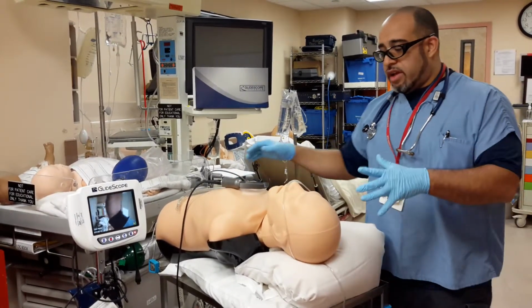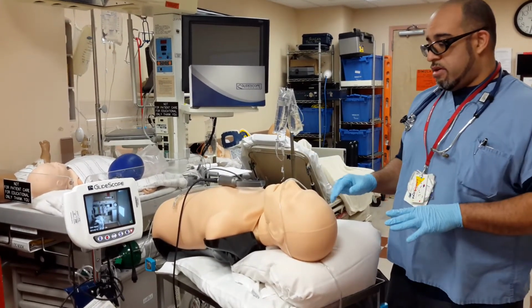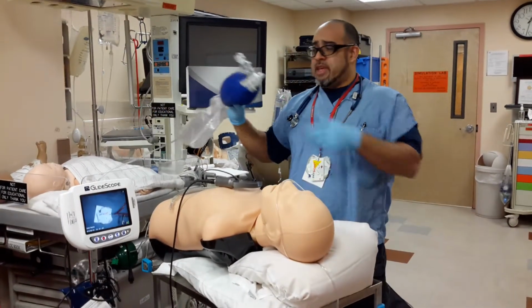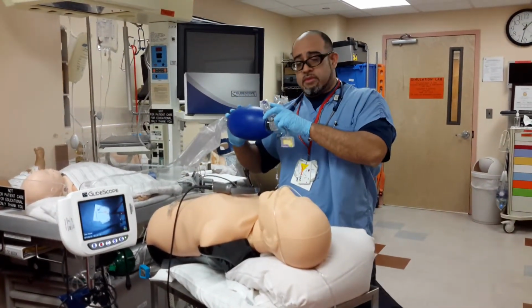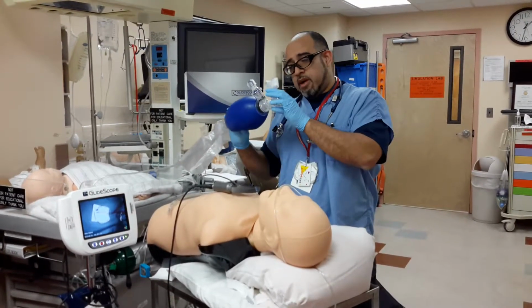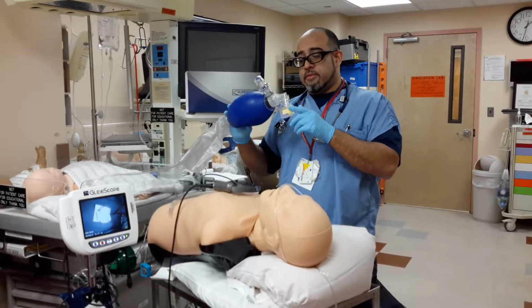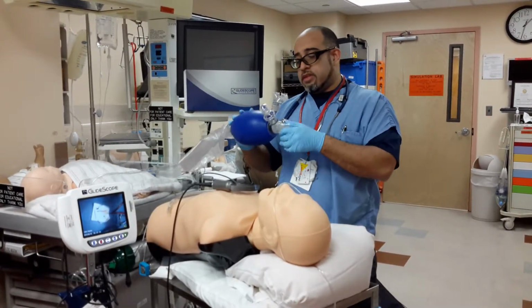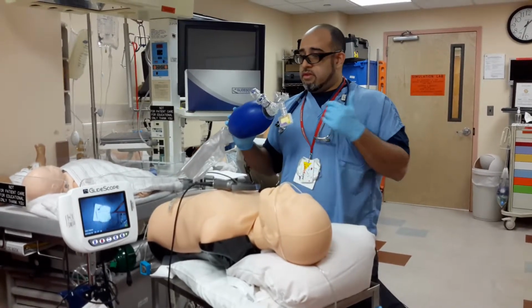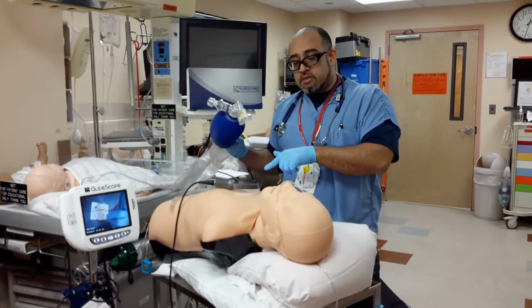Okay, I'll get stuff ready. I've kind of ramped up the patient as best I could, this mannequin. Put the high flow nasal cannula, 15 liters. I got my BVM souped up, with the PEEP valve, the capnometer. Of course, better than this would be the end-tidal CO2 continuous capnometry. But I have it ready in case I need to provide rescue oxygenation before the intubation or after a failed attempt. No product is perfect.